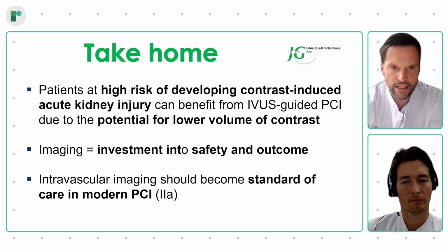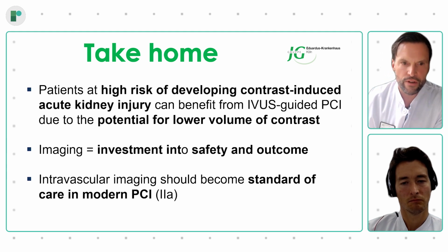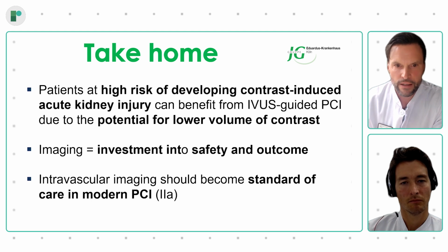Currently, we have a class 2A indication, which will change, I would say, in the future, because the guidelines are from 2018, and we have some new data out there that will help to improve this guidance, and to add new evidence on the use of intravascular imaging.